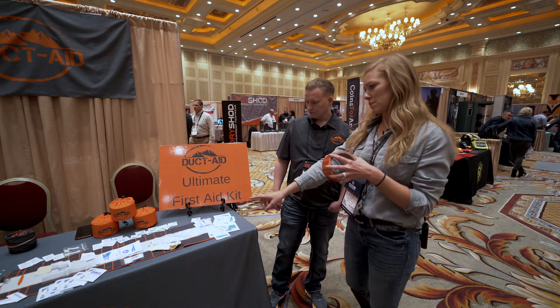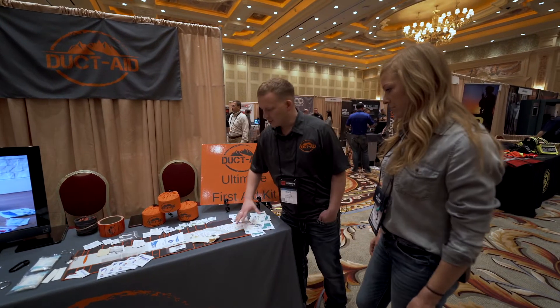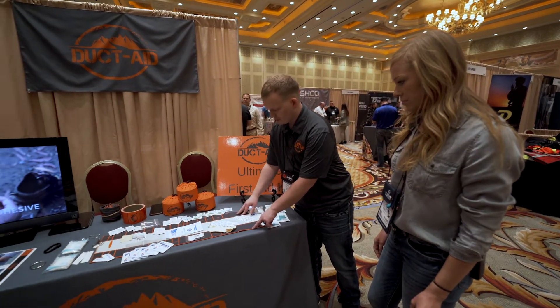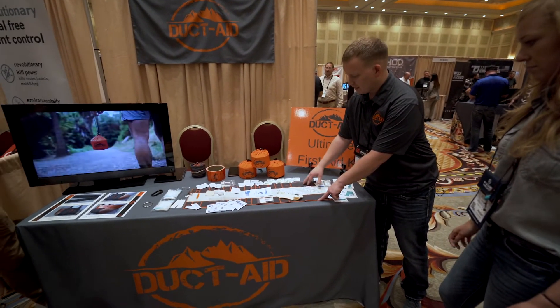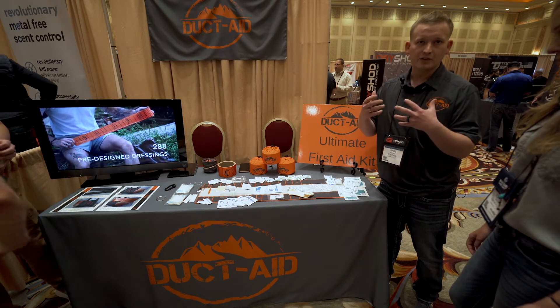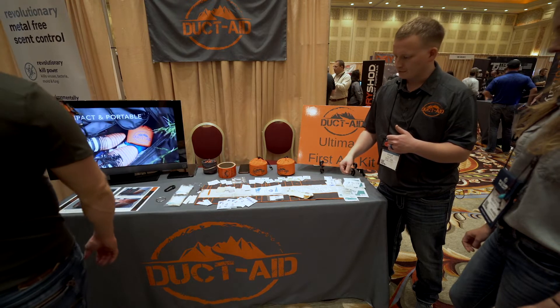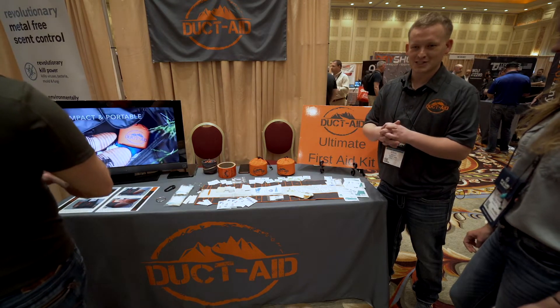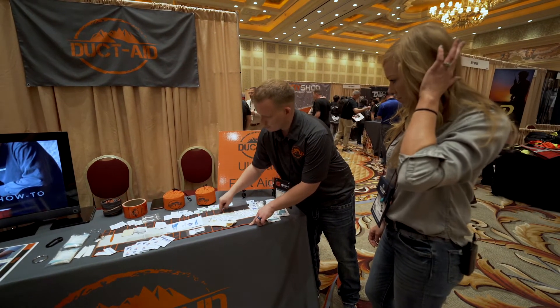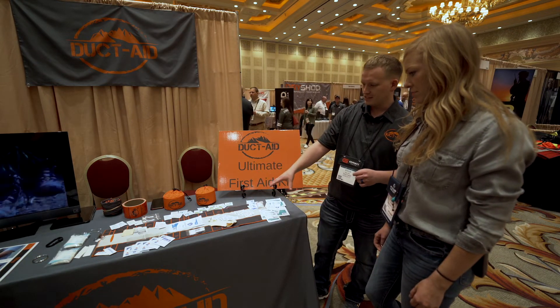Let's walk through some of the details of the design of the actual packaging. You have here all the different components that are inside the duct tape kit. The biggest one is this cloth that's laying underneath all of our pieces. This cloth is designed with a sling built in — you cut it and it can function to get you out of somewhere if you break your arm or dislocate your shoulder, to get you out of the backcountry to the hospital. It also has all these pockets, all labeled so you know what's inside each one, and everything laid out here fits inside that.